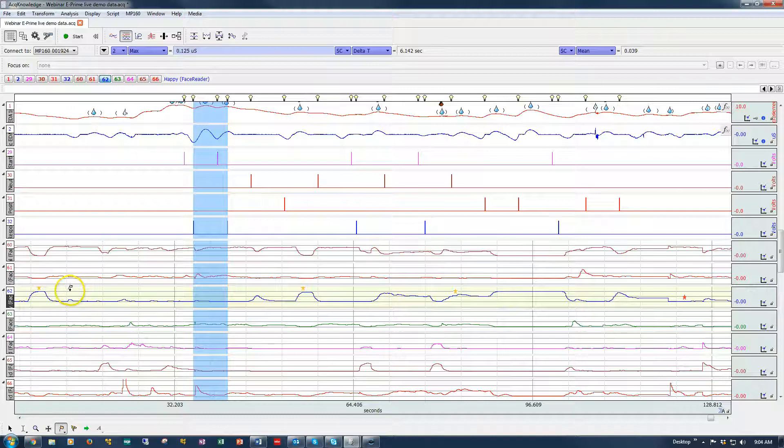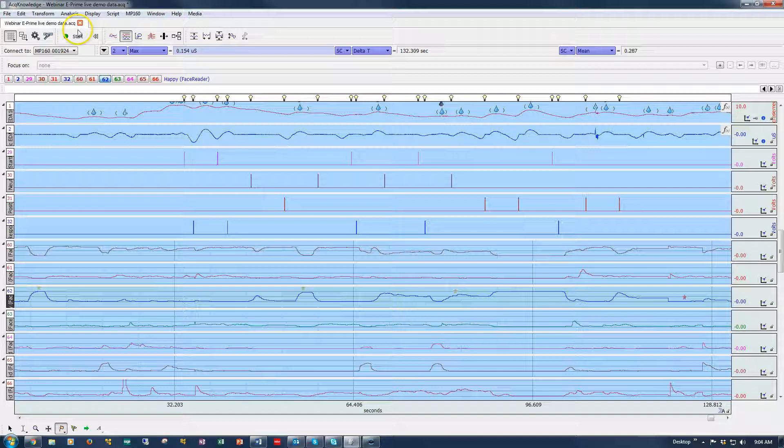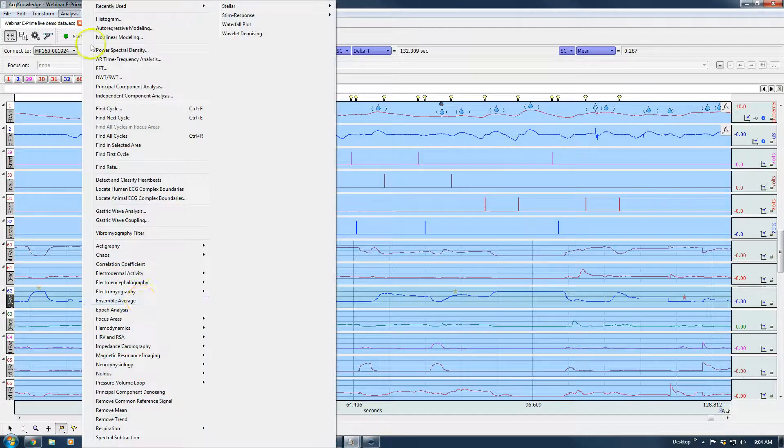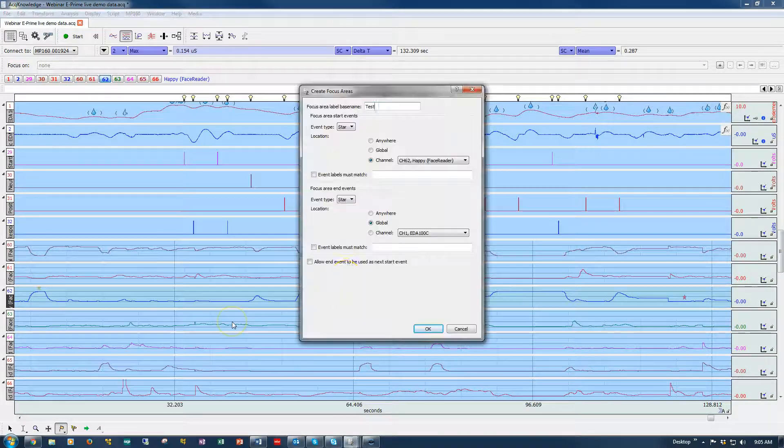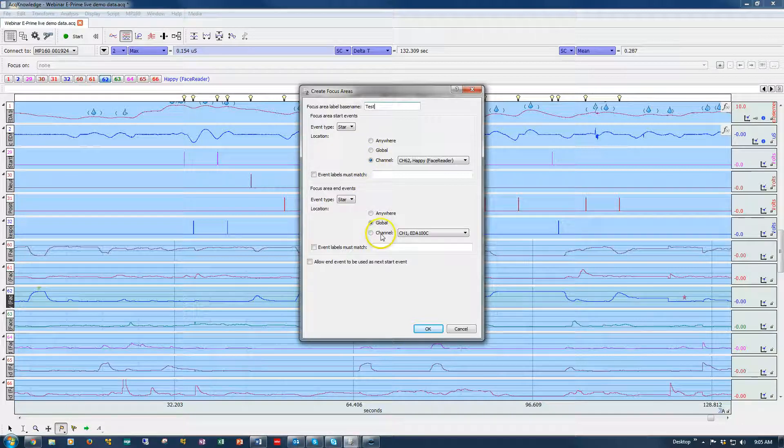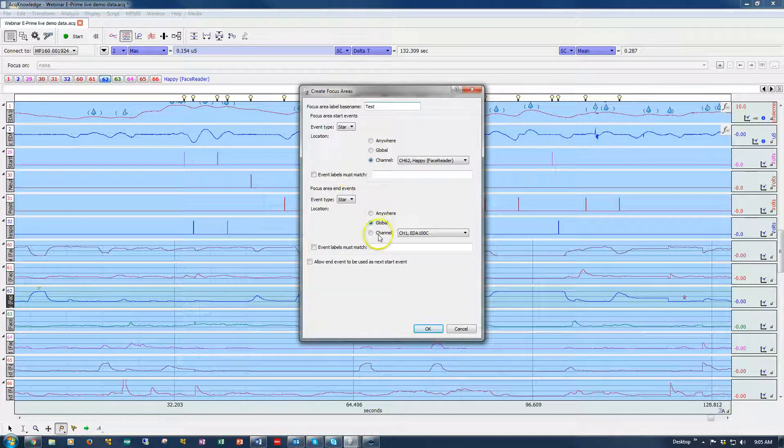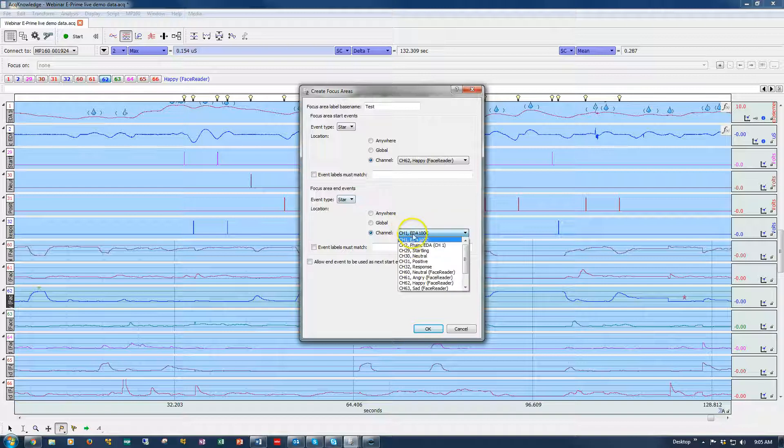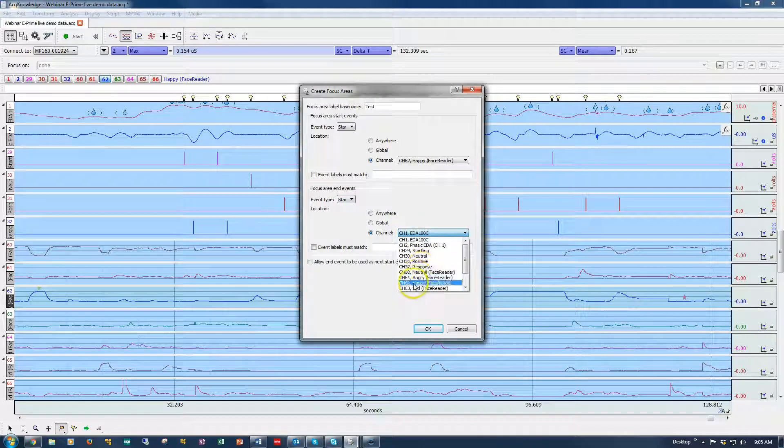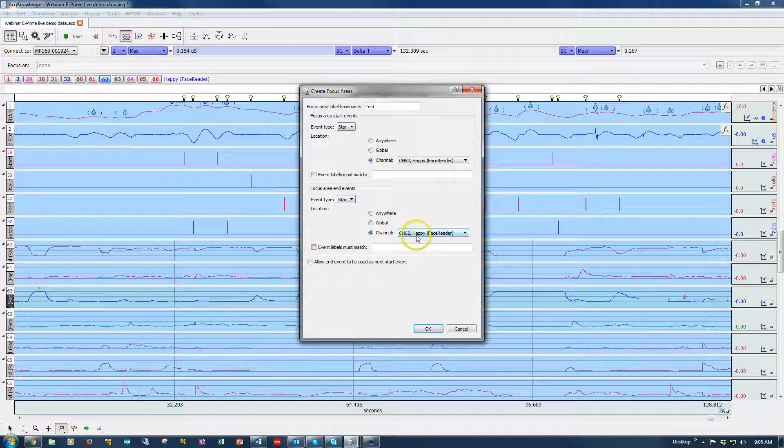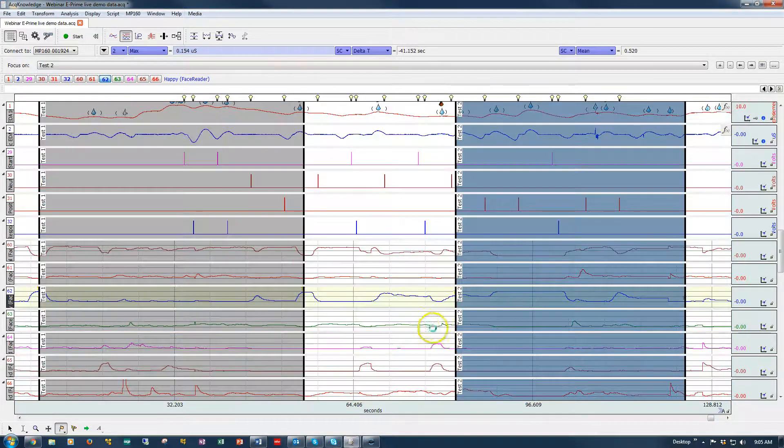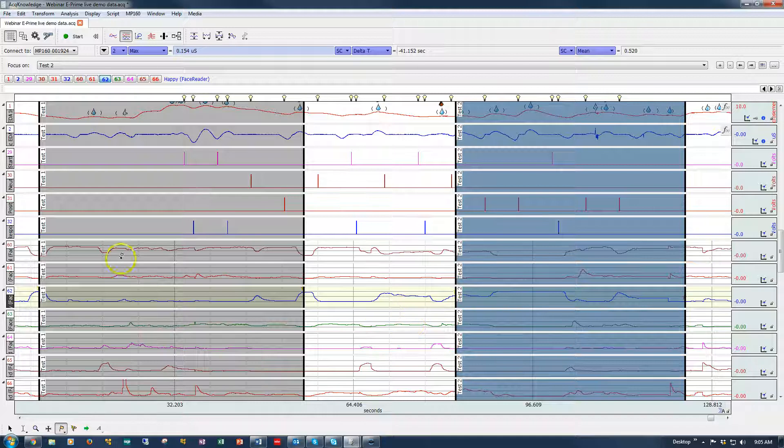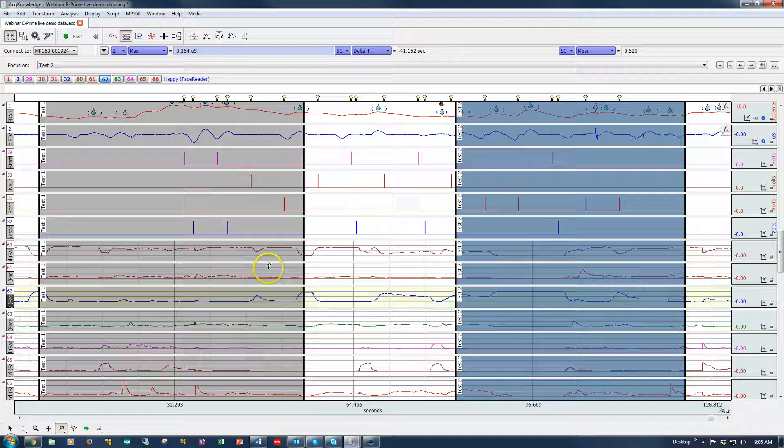And what did I do wrong? I did something wrong. Let's try that again. Oh, here we go. So it was looking for a star in the global. My mistake. Change this to channel 62. So now we're both set. We're looking for stars on channel 62 without labels. We'll try that again. OK. Perfect. So now we've created these two boundaries. Test focus 1, Test focus 2.